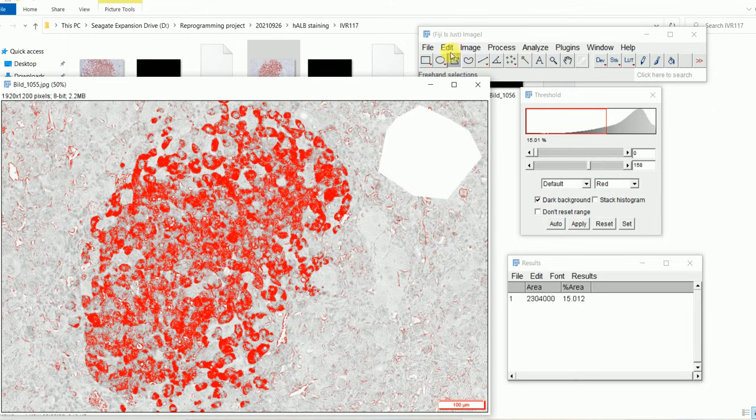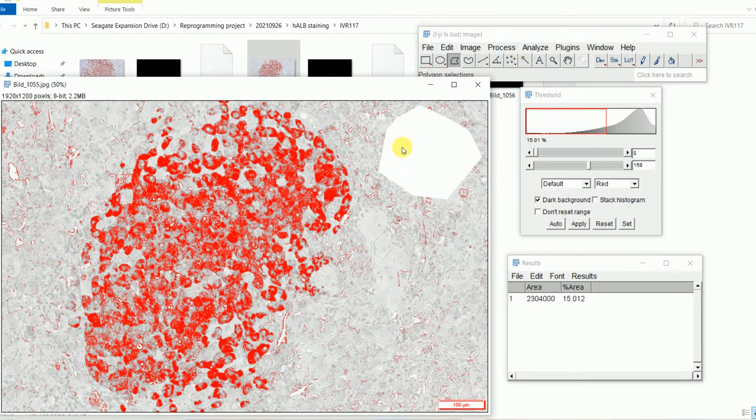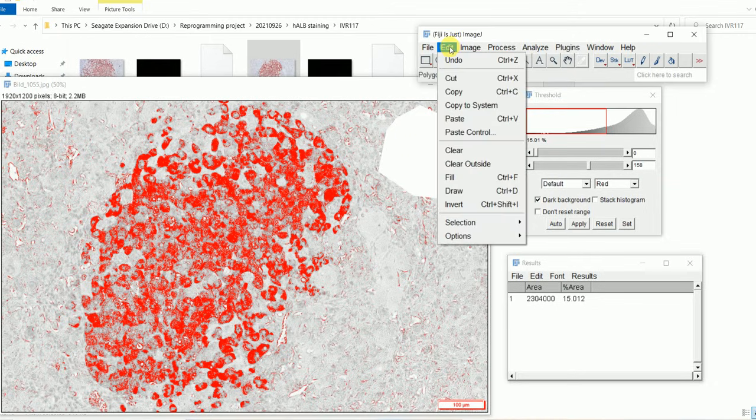But when you select it, to make it appear white, what you have to do is, in my case here it's already appearing white, but in normal cases it will not appear white. Okay, I got it. So in normal cases it will not appear white.